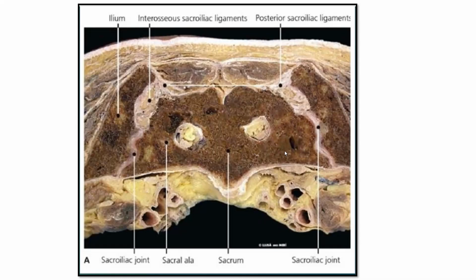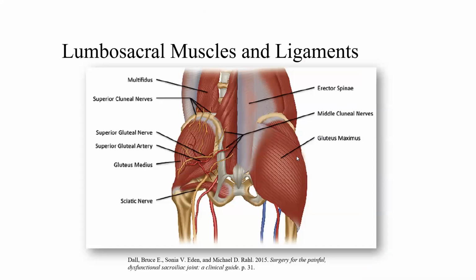The important anatomy, as you can see, is very clear with the S1 foramen having to be avoided, and of course there's a large number of vessels and neural structures anteriorly which need to be avoided. There's a very robust posterior ligamentous complex that gives the stability of the joint, that when you approach just the articular area in the front, these are not violated and still maintain stability.